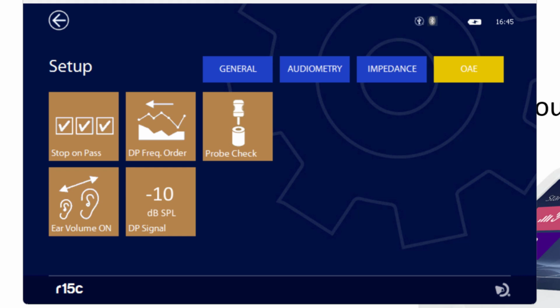Another comment that I learned today is that maybe when you see people using the r14o in the clinic and you show with their instrument to use this test cavity, this test cavity fits very, very narrow around the probe tip.